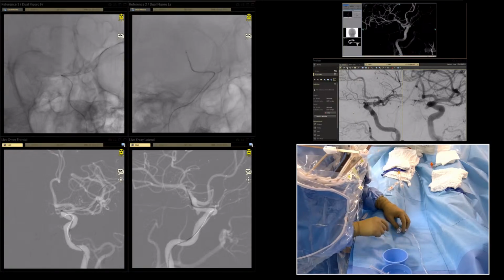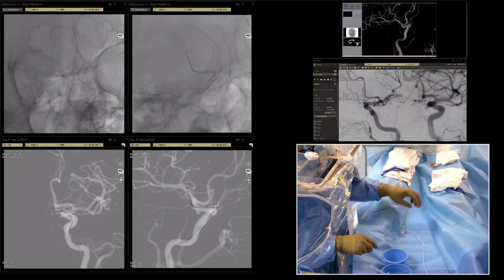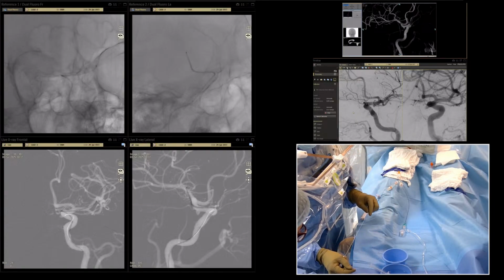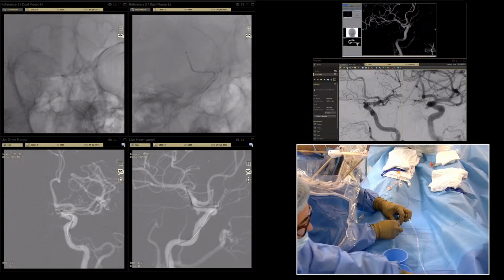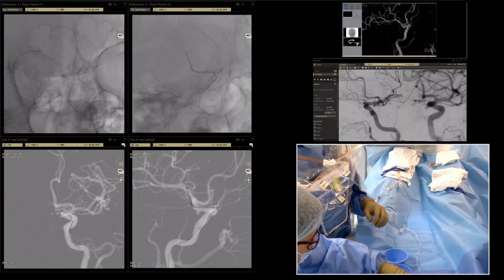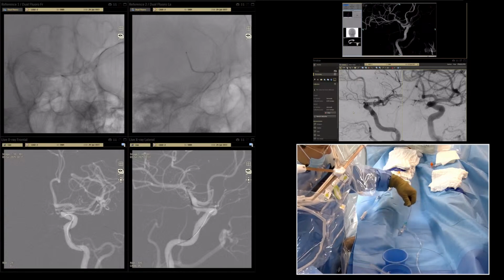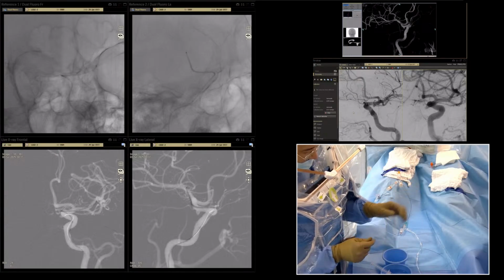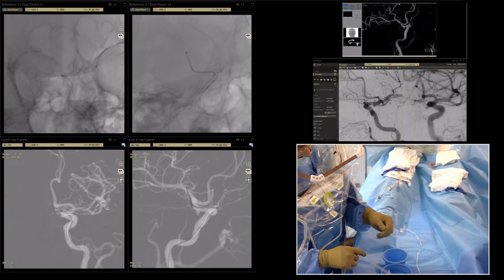And also I noticed from Adnan Siddiqui, he has a lot of tools from interventional cardiology for ICA chronic occlusions. And yes, the distal 3 centimeter of this wire is quite soft. I want to show you. The length of the wire is nearly 160, 170 centimeter, and the distal part is quite stable, but its distal 3 centimeter is soft.